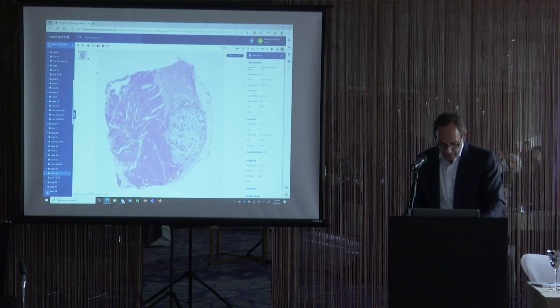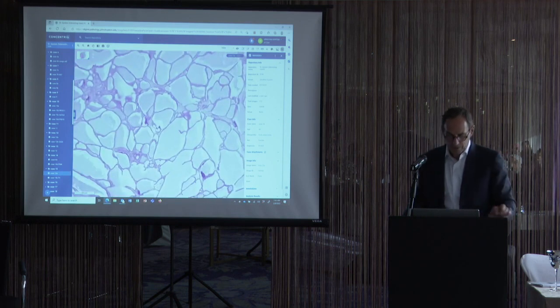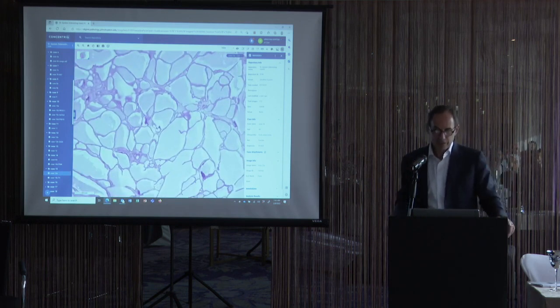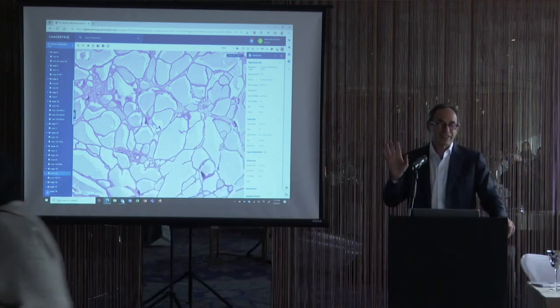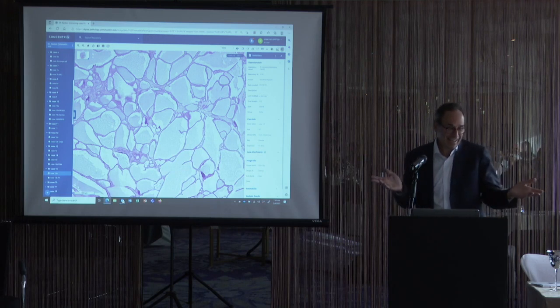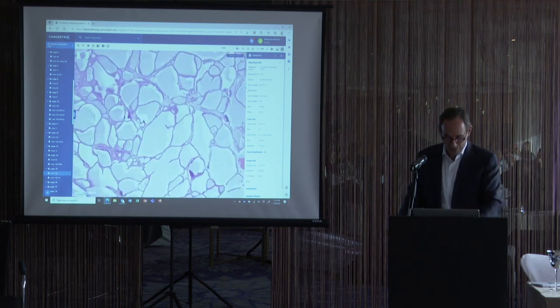This is a renal mass, and it has two components. So this one component, my wife made a point that I might be incorrect. So does everyone know what Swiss cheese is? Maybe people don't have Swiss cheese in Kuwait. Do you know Swiss cheese with the holes in it? Okay, fine. Well, I had to ask. So this is kind of a Swiss cheese area with these open holes.